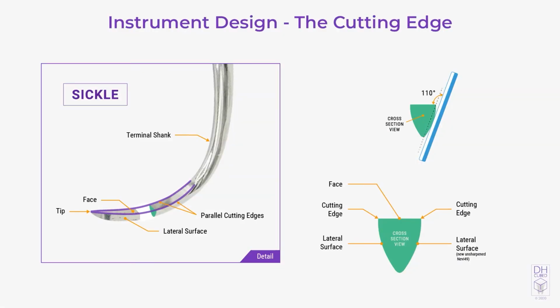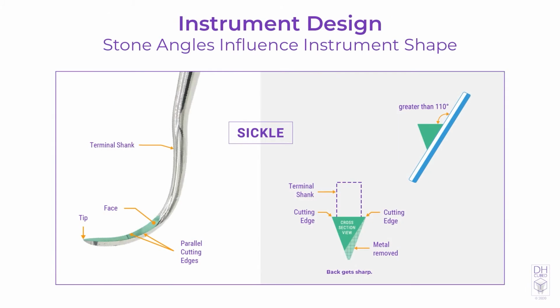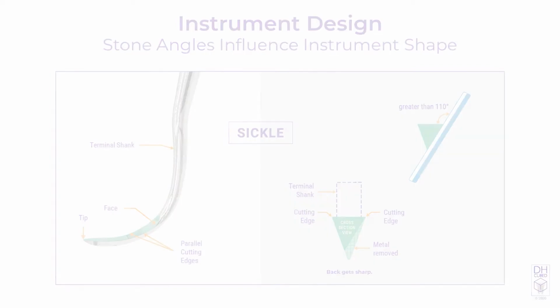For example, in cross-section, visualize the correct 110-degree angle for sharpening the sickle scaler. Visualize what the shape of the sickle will be as a result of sharpening it at greater than 110 degrees. Notice that the back gets thinner while the face stays the same, and the back will get very sharp. Eventually, the integrity of the instrument can fail and potentially cause the instrument to break while scaling.